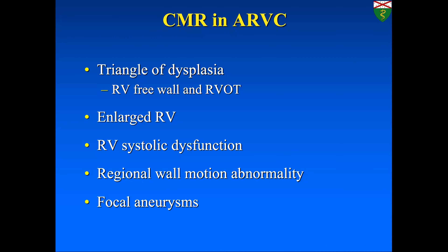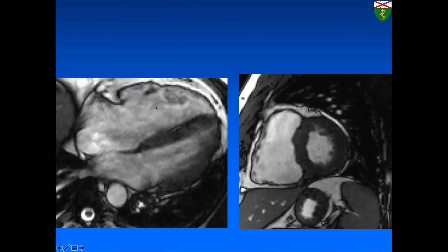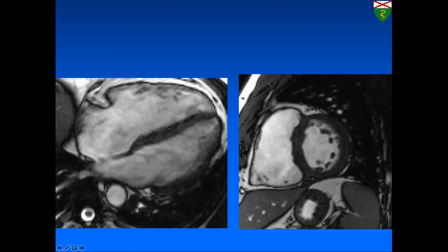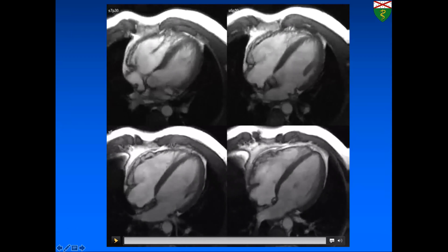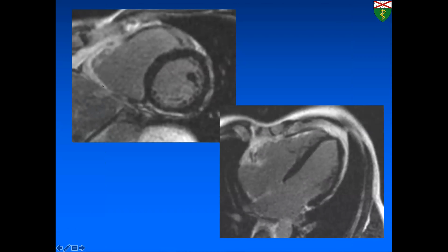Pay particular attention to the triangle of dysplasia — the RV free wall through the RVOT. An RVOT view will be helpful. On imaging, you will see an enlarged ventricle with poor contractility, systolic dysfunction, regional wall motion abnormality, and potentially focal aneurysms. In one patient with ARVC, the right ventricle is dilated with low contractility and focal dyskinesis on the lateral free wall. Another patient shows the classic accordion sign — a corrugated, akinetic appearance of the ventricle. Delayed enhancement involving the right ventricle can be seen in ARVC but is not part of the task force criteria. Fat infiltration, which used to be a criterion for ARVC, is no longer one.